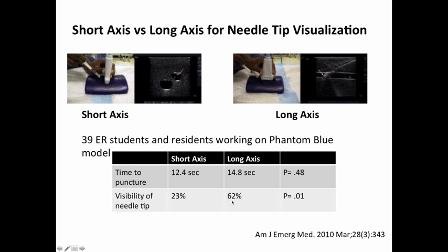And so what I've seen folks do in short axis is to place the probe over the vessels and then enter with the needle, but not move the probe at all. And so don't see the needle in the lumen. Exactly, which is useless. I don't know if it's completely useless, but ideally you should see the tip of the needle all the way down. And so there are two ways to do that.